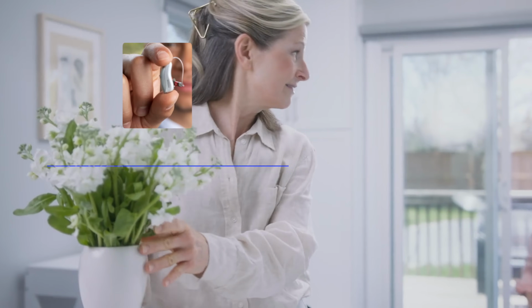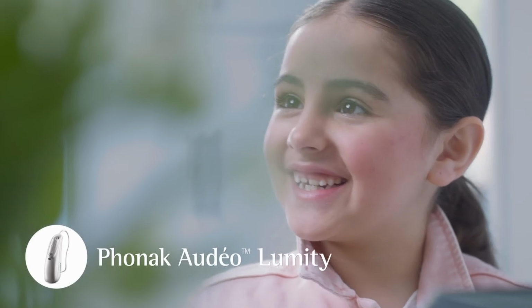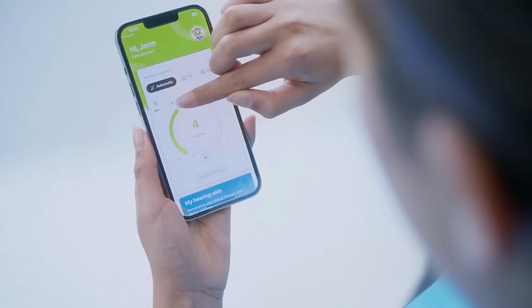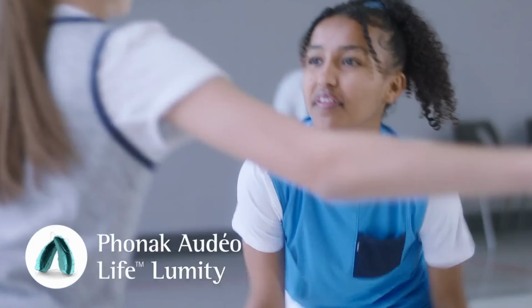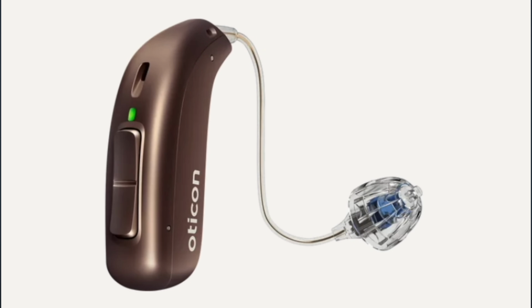Well, there you have it, my 6 top picks for the best hearing aids of 2024. Let's do a quick recap. We started with the Phonak Audeo Lumity receiver and canal hearing aids that utilizes Bluetooth Classic, allowing for connection to nearly any Bluetooth-enabled device, and is the perfect hearing aid for someone who wants a device that will automatically adjust program settings for them. Next, we had the Oticon Real that uses an onboard deep neural network to keep you aware of surrounding sounds while providing exceptional speech clarity, even with the use of a non-custom dome.